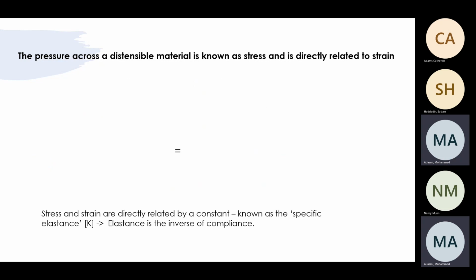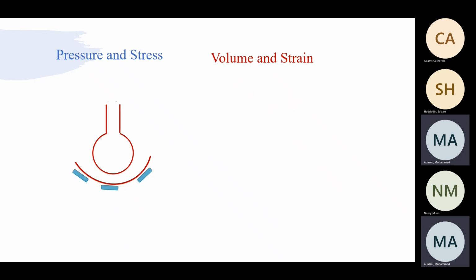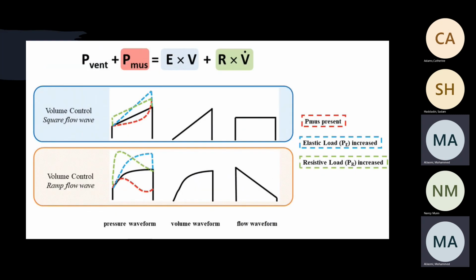So do you call this double triggering or breath stacking? I don't like to use breath stacking, but that's the machine: the machine triggered the first one, the patient triggered the second one. But some people will say this is reverse triggering, because the machine triggered and then I triggered. If I would like to know whether it's reverse trigger or not, that's why I asked to decrease the rate, and let's look. If it stays the same, then that's reverse trigger.